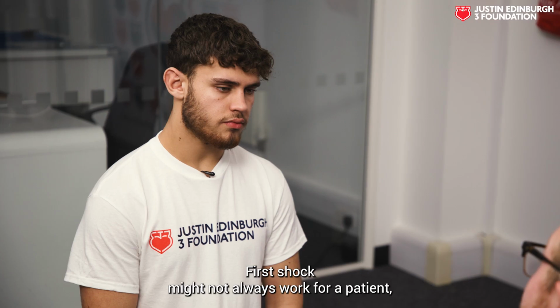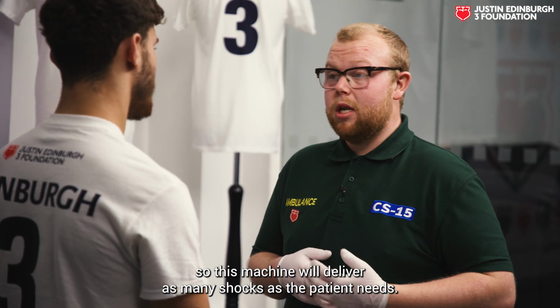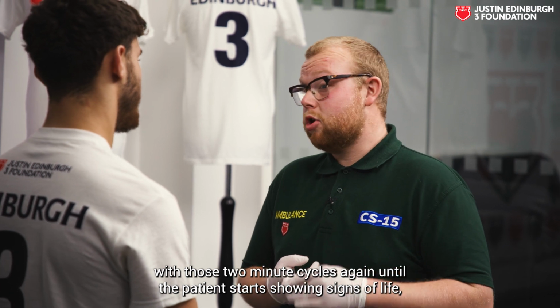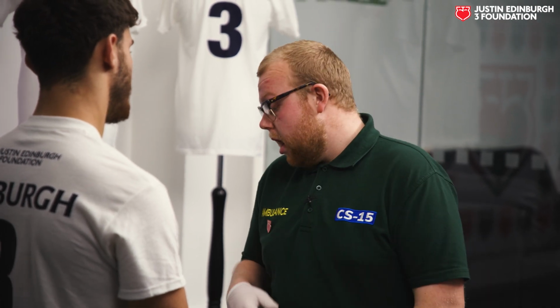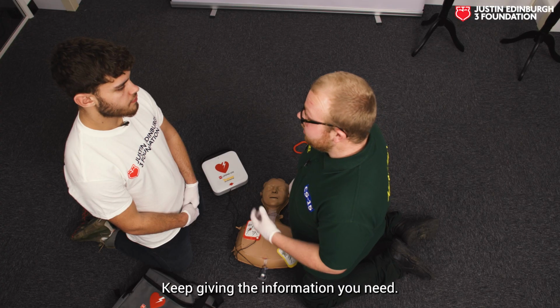So really nice work. First shock might not always work with a patient, so this machine will deliver as many shocks as the patient needs. You just keep going around in those 2-minute cycles, again, until the patient starts showing signs of life, until the ambulance service tell you to stop, or until someone else has to take over from you. But the machine will just keep giving you that support, keep giving you the information you need.